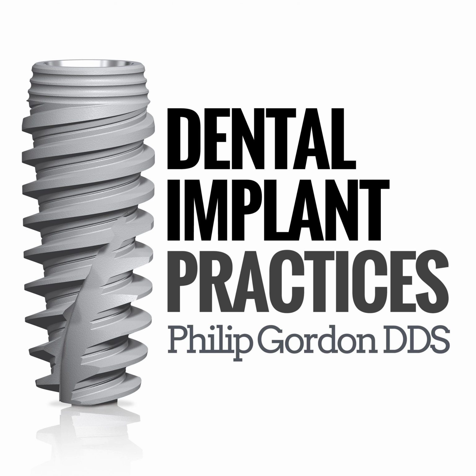Correct. Okay, because a lot of things I've heard in the past say, separate the teeth a little bit in the scan so you can separate the arches. You prefer the bite down. You'd be surprised at how much you can see. Sure. With that bite registration in place. It's pretty neat. Yeah, even with the teeth together, you're able to differentiate. And as well as, too, we have those models that we can also bring into the scan digitally to help us out with that as well. Okay, great. So that sounds pretty straightforward. I don't think there's many people that have any confusion with that.